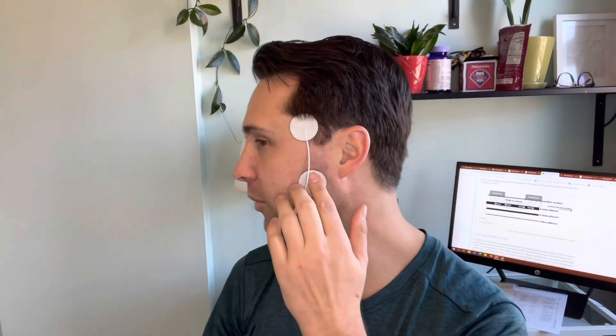For one-sided jaw pain or face pain, I would use smaller electrodes. I'm placing one up here on the temporalis muscle at the temple, and then another electrode over where the muscle belly of the masseter is — if you clench your teeth you can feel where it is. You want to put the electrodes right over where the pain is. The hairline can get in the way and prevent electrodes from sticking well, so that may be a problem for some placements.